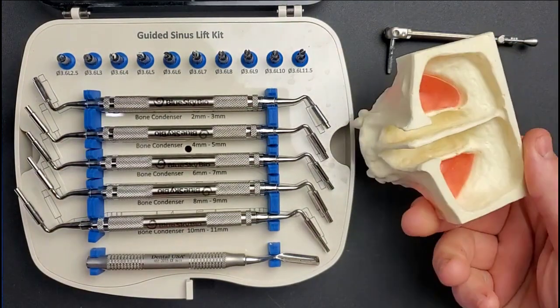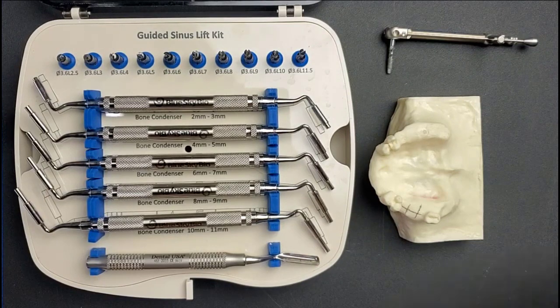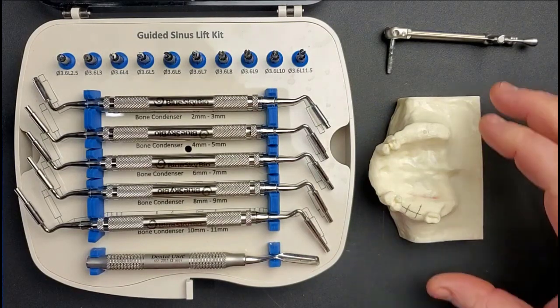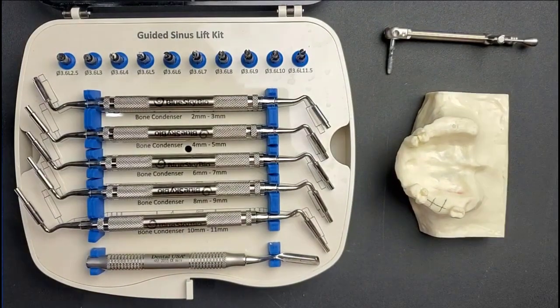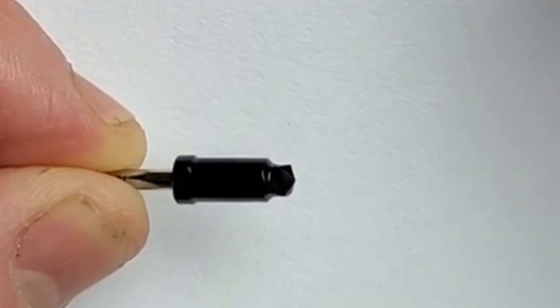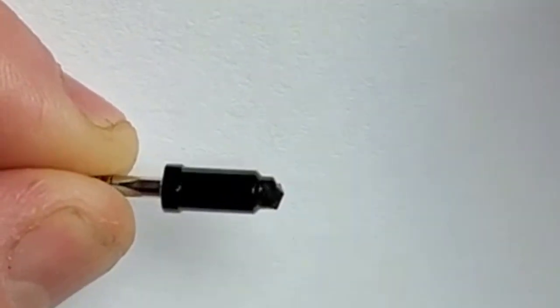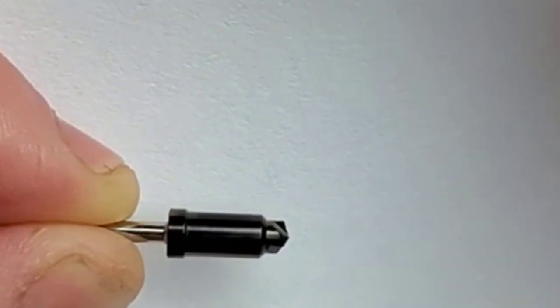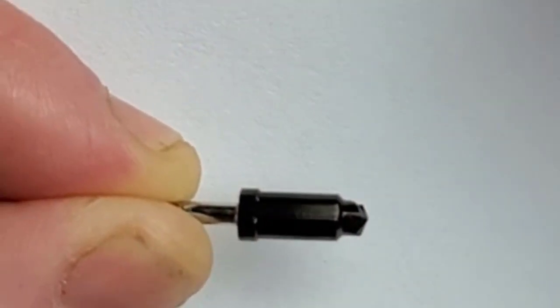We've got our sinus model here with a little rubber membrane intact and I want to show going through the entire process. Generally if you're doing this, you're going to have a preoperative CT or some x-rays to know approximately how much bone you've got to the sinus floor — in this case on these models it's about six to seven millimeters. Let's start with the very first drill in the kit. As you look closely you can see it is pointed on the end — this is a non-safe-ended, end-cutting burr. It's really just a profiler to give all the other drills a purchase point so your drills won't walk all over the place.